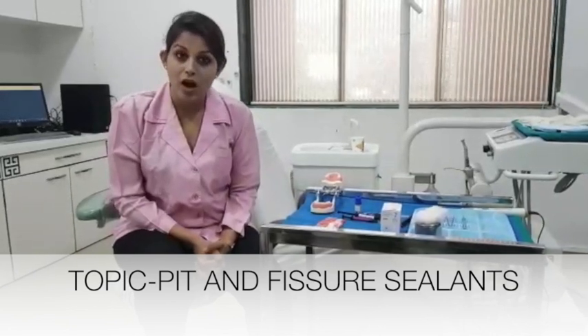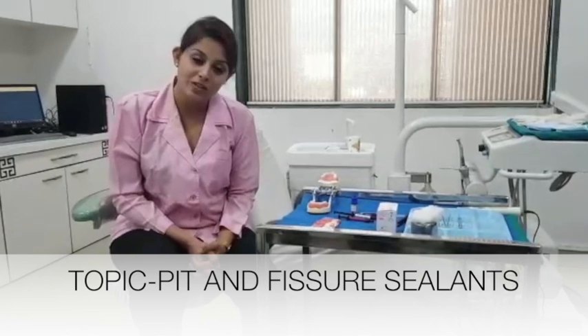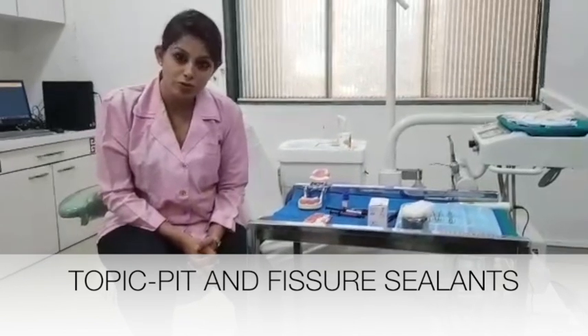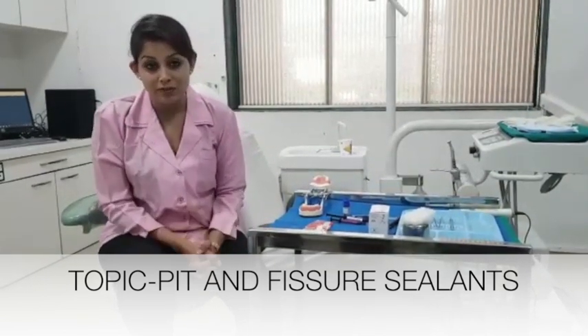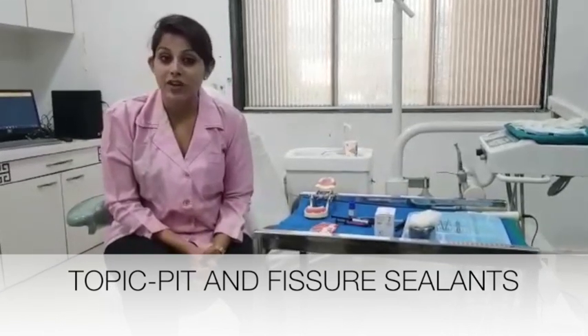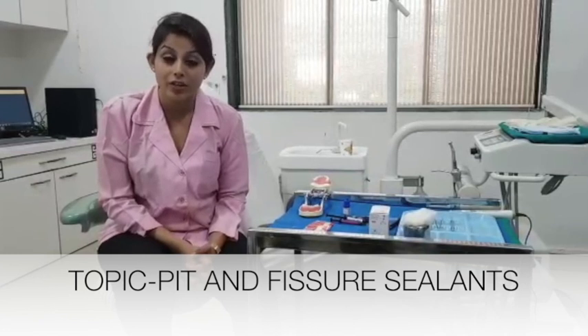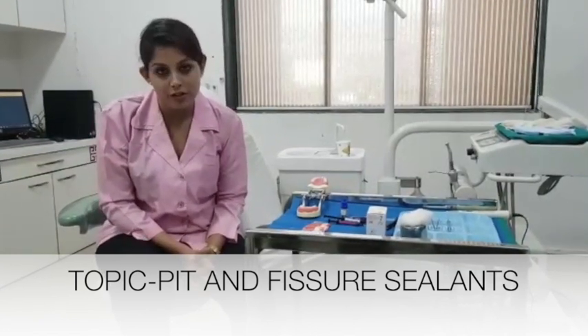We are going to show you how to execute a procedure in relation to pit and fissure seals. We all know that we have those deep grooves, those pits in the molars and premolars — they are the pits and fissures — and it is very necessary to seal them at a very young, very early age to prevent further cavitation and prevent further decay.